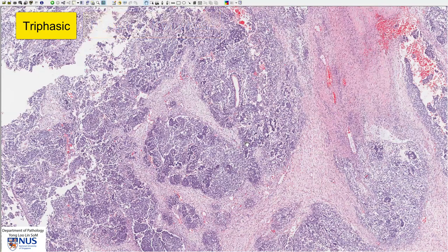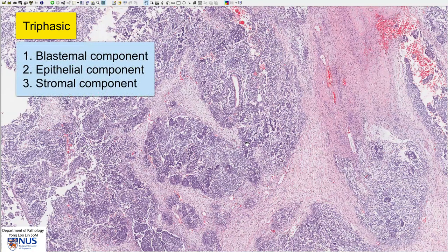This is a triphasic Wilms tumor and it has the three components. First, blastema, which is very undifferentiated embryonal type tissue. Secondly, the epithelial component, which tends to form tubules. And thirdly, the stromal component, which is composed of spindle cells. Let's look at them one by one.